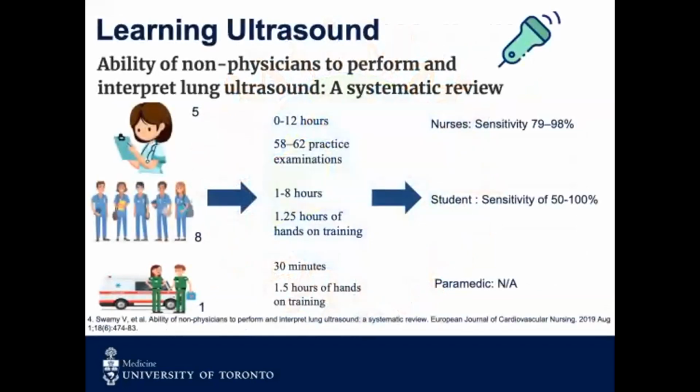One thing I put in here, which is a little bit fun, is a study that looked at the ability of people who weren't physicians to perform and interpret lung ultrasound. And so this was a systematic review which looked at the ability of nurses, medical students, and paramedics to perform lung ultrasound and specifically detect B lines and pleural effusions in patients who had heart failure or had symptoms in keeping with heart failure. And so the secondary goal of this was also to determine the exact level of training to be proficient in lung ultrasound.